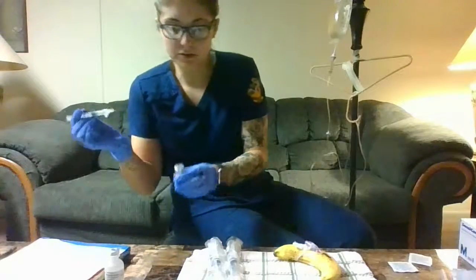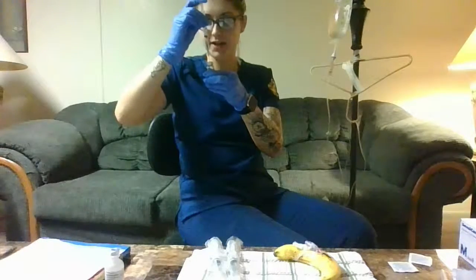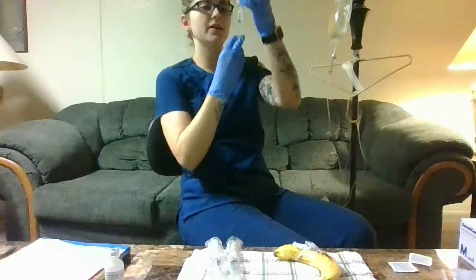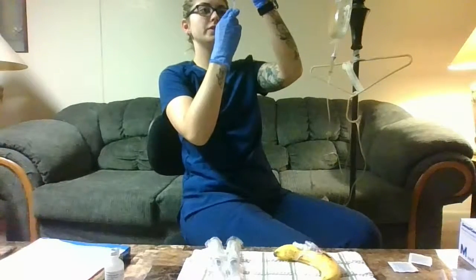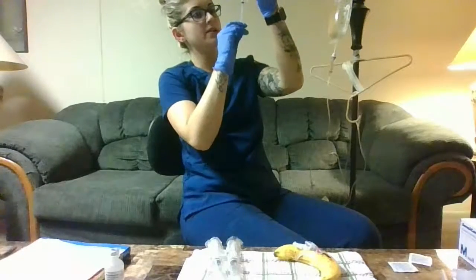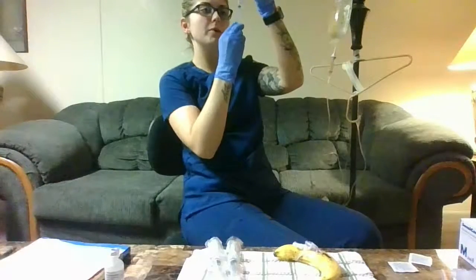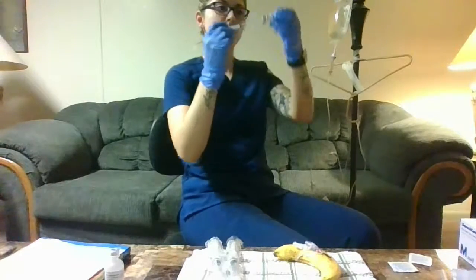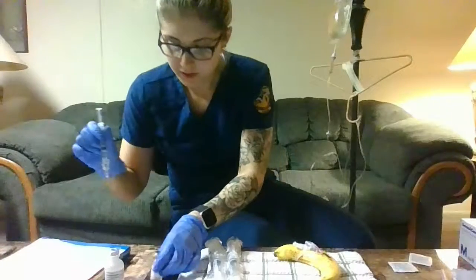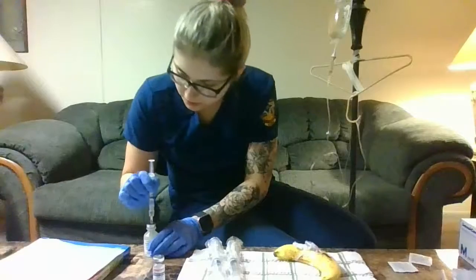We are going to insert through the top, put the air in, flip it upside down. We're going to draw out 1 milliliter, making sure we don't have any bubbles or anything in there. Okay, so we have 1 milliliter here. Then we're going to inject that into the normal saline.